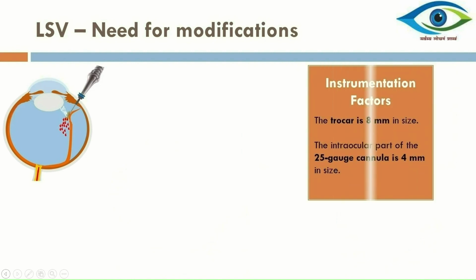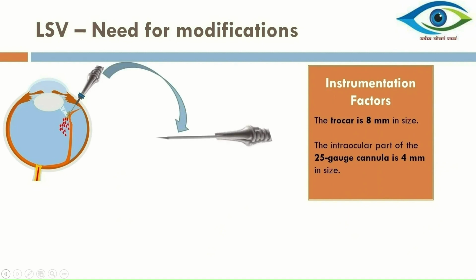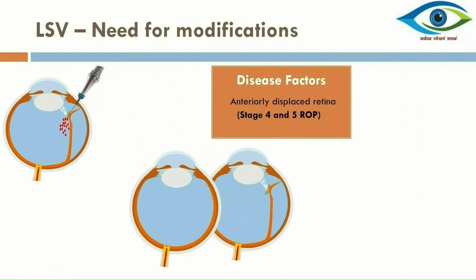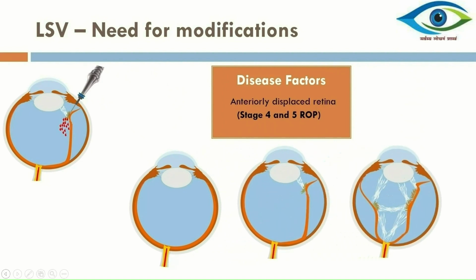The second factor is related to the readily available instruments, which are meant for VR surgery in adult eyes. The length of the trocar is 8 mm, while the length of the intraocular part of the cannula is 4 mm. These relatively longer instruments increase the risk of retinal injury in infant eyes. And the third factor is the disease itself, where the peripheral retina is anteriorly displaced, compromising the surgical space in stage 4 and 5 ROP.